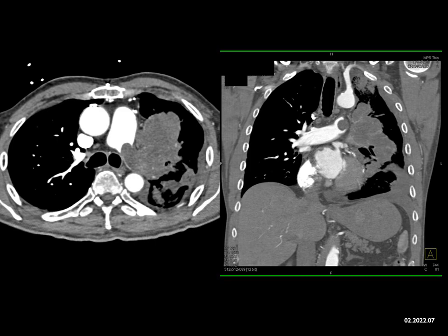Maybe it's metastatic sarcomas, which do occur. Maybe it's lymphoma, though lymphoma usually compresses, not directly invading the pulmonary artery.